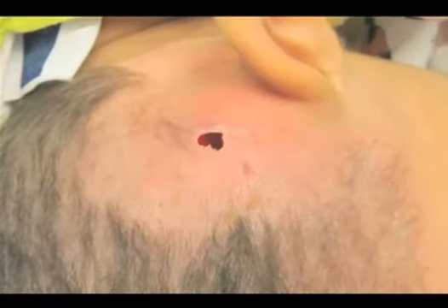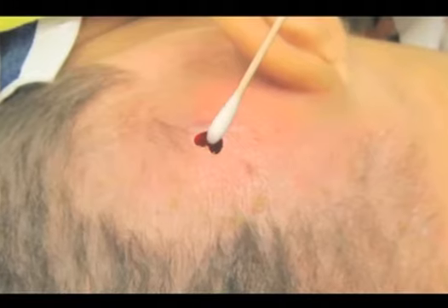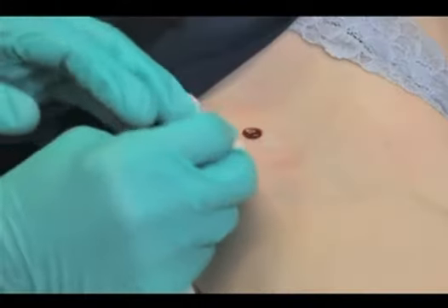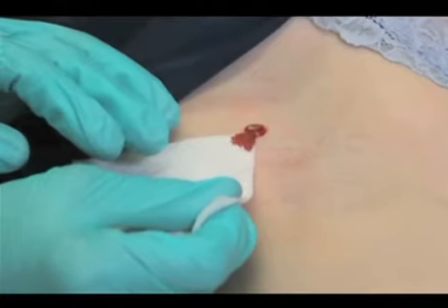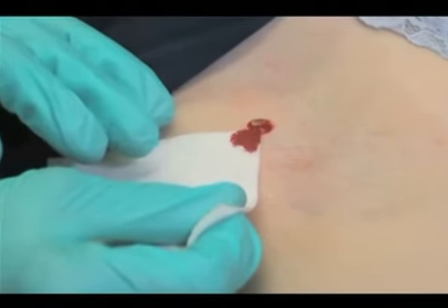On scalp, bleeding may be brisk. The assistant can occlude the punch defect with a cotton tip applicator so the surgeon can visualize suture placement. Alternatively, place the corner of a gauze at the punch defect. The gauze will absorb the blood flow by capillary action, allowing for visualization for suture placement.